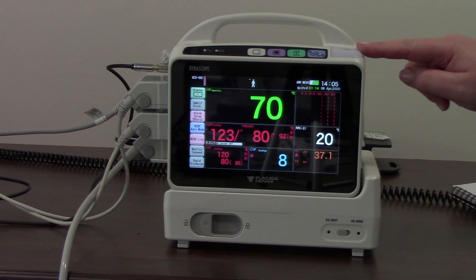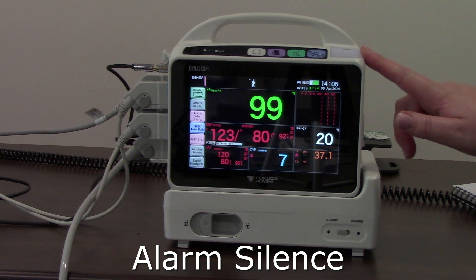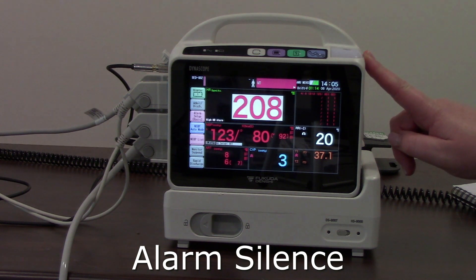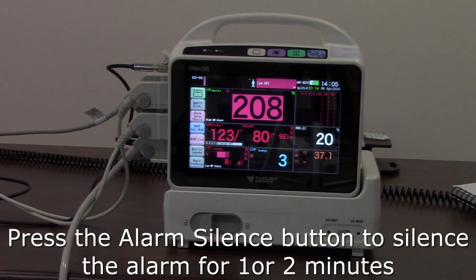To start with, there's the alarm silence button. When the alarm goes off, the button at the top of the monitor will flash. We'll activate an alarm so we can see how that works. You'll hear the monitor alarm and see the alarm silence button start to flash. Press the flashing alarm silence button and it will silence the alarm for one or two minutes, depending on how your monitor has been set up.